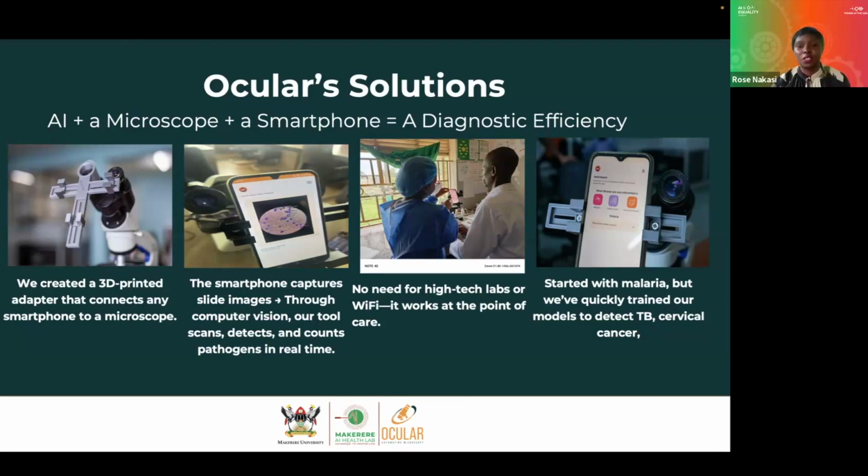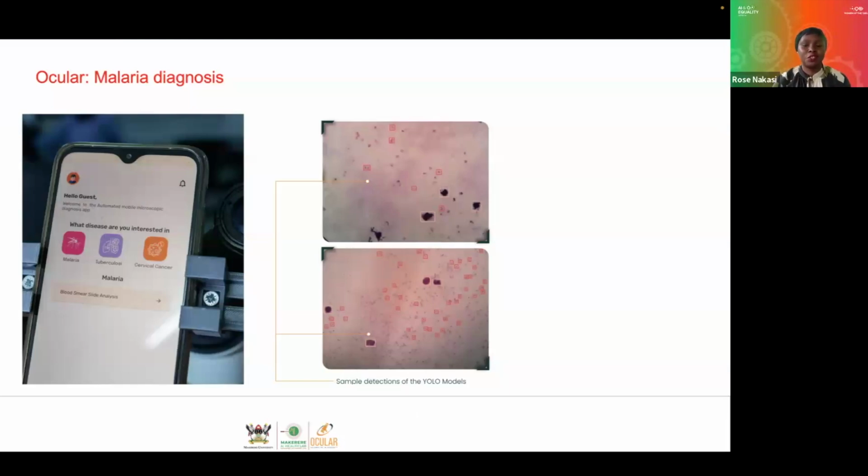And then we utilize different machine learning models to understand the features of the objects of interest, which could be parasites, which could be bacilli, which could be any malignant case for cancer. So here you can easily see that the artificial intelligence model that has been trained across so many images has been able to learn the characterizations of the malaria parasite and is able now to bring inference onto the image, directly supporting the annotation of these parasites onto the blood slide image, so that the expert is able to just look at what the model has done and then provide a final confirmation of the results.